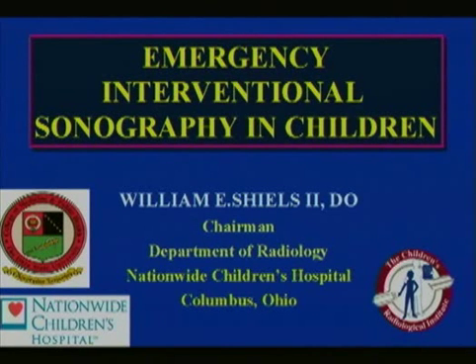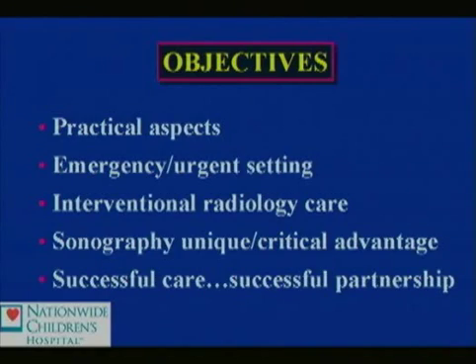Today we're going to speak about emergency interventional sonography in children and the applications of sonography for urgent and emergent situations. We'll focus on practical aspects that we encounter in pediatric radiology and, to a lesser degree, in the care of adults with either congenital disorders or unique situations that require children's hospital support and care in the emergency or urgent setting, where interventional radiology is called upon to support the care of the patient, and particularly in situations where sonography provides unique and or critical advantage in the performance of the interventional radiological procedures.